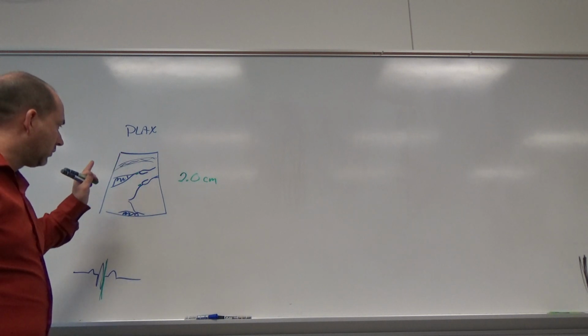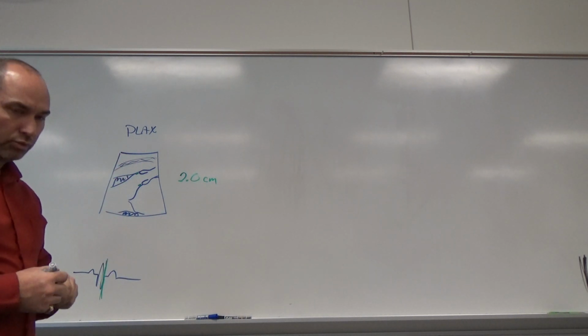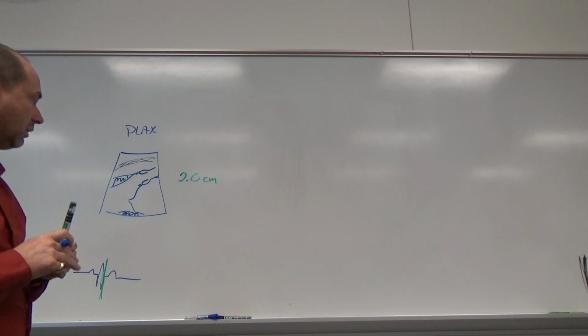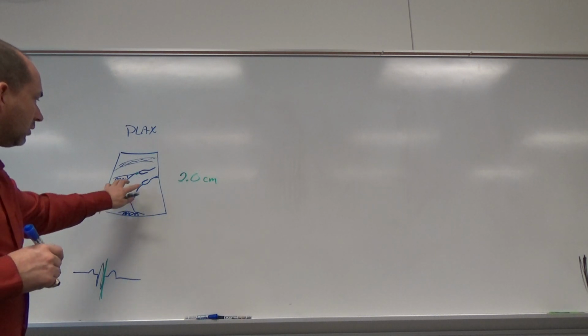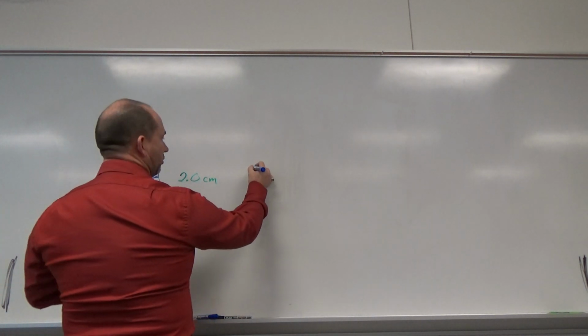So we covered the walls, we covered the LVOT now, we covered the aortic root, the left atria, and then in M mode we also covered the EPSS. Okay, so let's go just beyond this. We also want to look at components of the aorta. So I'm just going to draw the aorta here now.